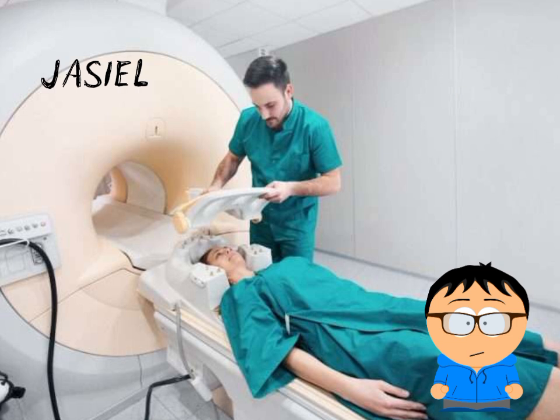The main parts of a magnetic resonance imaging system include: 1. Magnet, which generates the magnetic field needed for magnetic resonance imaging. This can be a permanent magnet or electromagnetic coils. 2. Coils, devices that transmit and receive radio signals. There are different types of coils, such as surface coils and body coils. 3. Control console, which allows the operator to adjust the scan parameters and coordinate the equipment's functions.